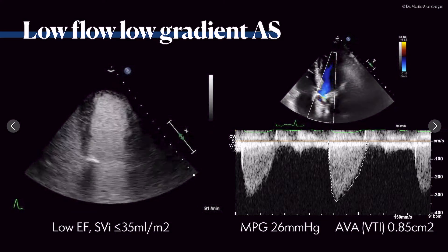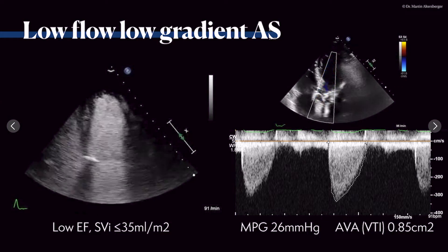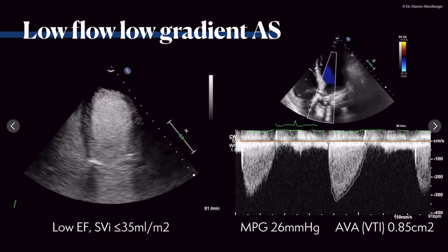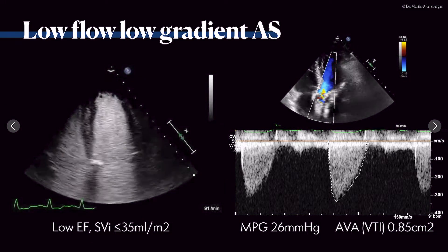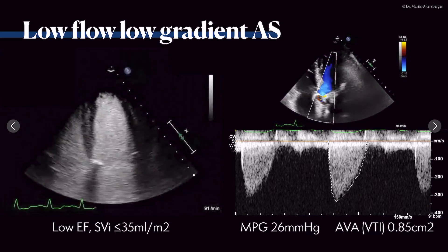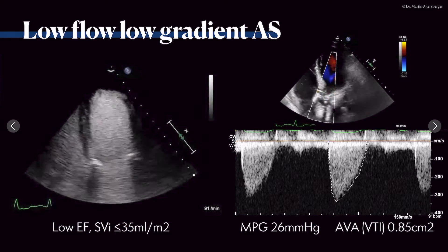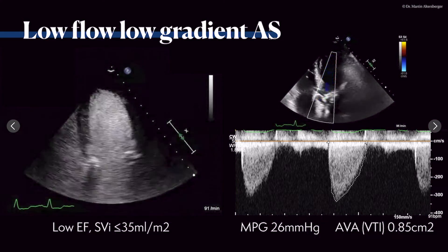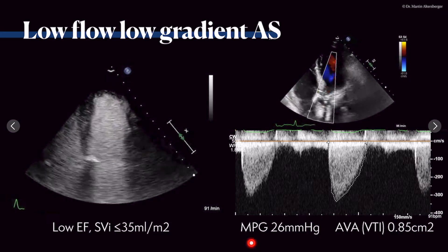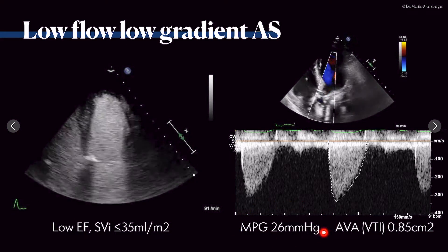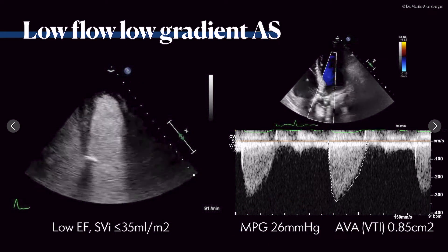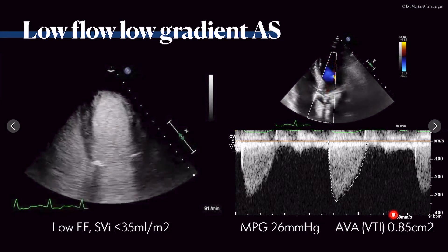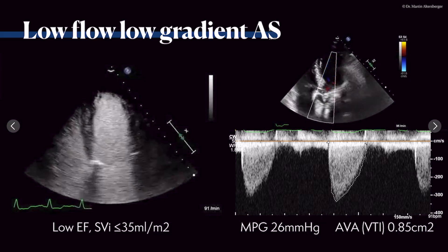How can we evaluate patients with low-flow, low-gradient aortic stenosis? Here you can see a low ejection fraction of approximately 35% with reduced left ventricular function, and the stroke volume index was below 35 milliliters per square meter. When we evaluate the continuous wave Doppler signals seen here, we get a mean pressure gradient of 26 mmHg and an aortic valve area showing severe aortic stenosis at below 0.85 square centimeters.